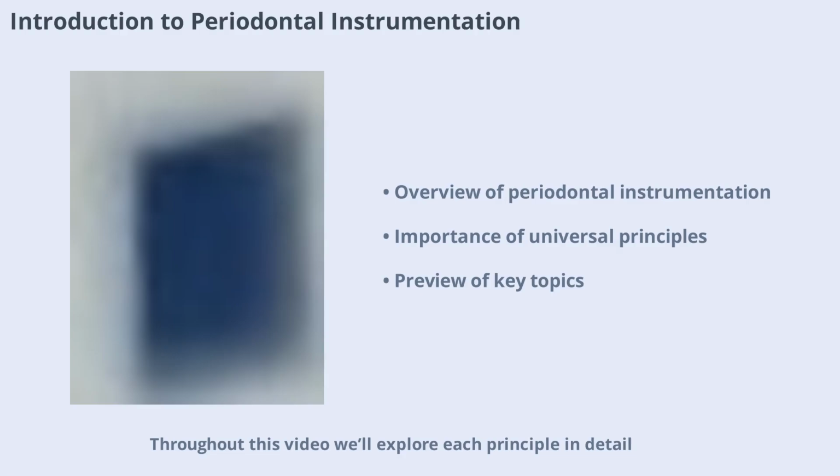Throughout this video, we'll explore each principle in detail, providing practical examples and visual demonstrations to help you master the art of periodontal instrumentation. Whether you're a student, clinician, or simply interested in dental procedures, understanding these fundamentals will enhance your skills and ensure optimal patient outcomes.